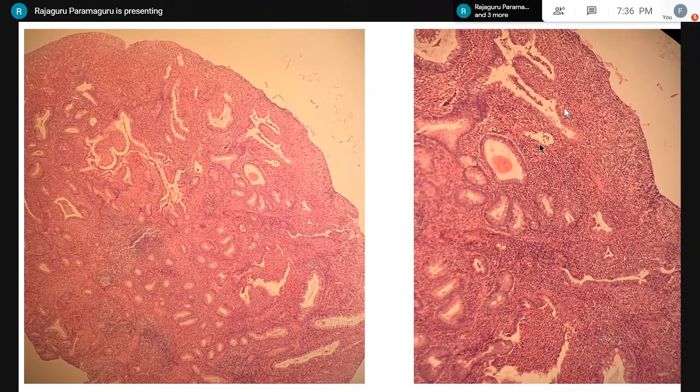If not, it is better to coin them as an inflammatory polyp, which can be seen in relation to many of the inflammatory conditions of the colon, and in the stomach it is called a hyperplastic polyp in relation to the gastritis that may be H. pylori related or autoimmune gastritis or any other gastritis for that matter.